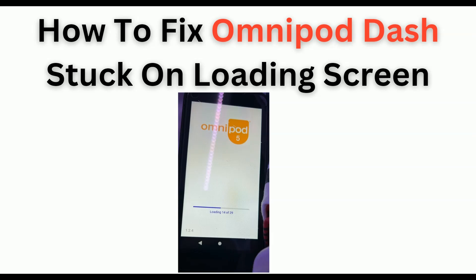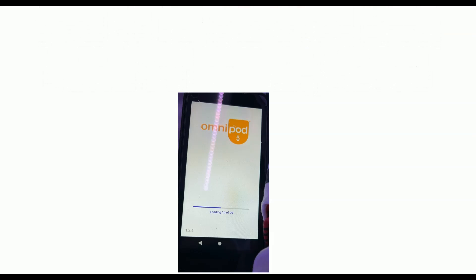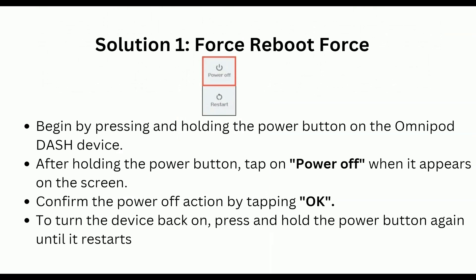Solution 1 is Force Reboot. Begin by pressing and holding the power button on the Omnipod Dash device. After holding the power button, tap on 'Power Off' when it appears on the screen, and confirm the power-off action by tapping OK. To turn the device back on, press and hold the power button again until it restarts.